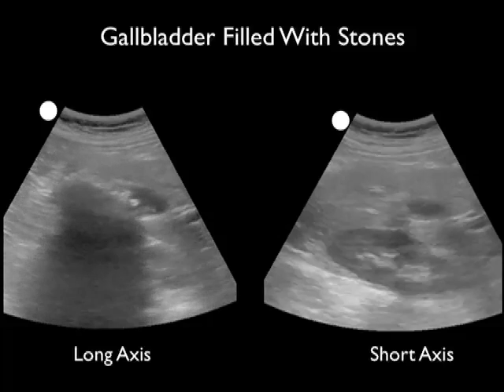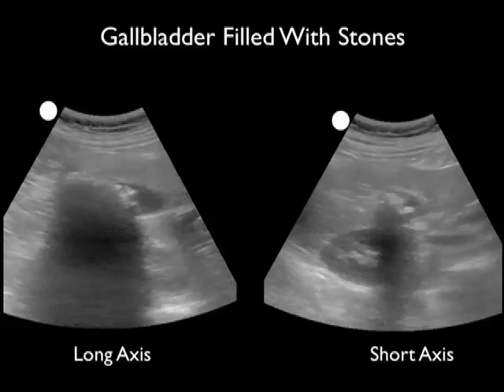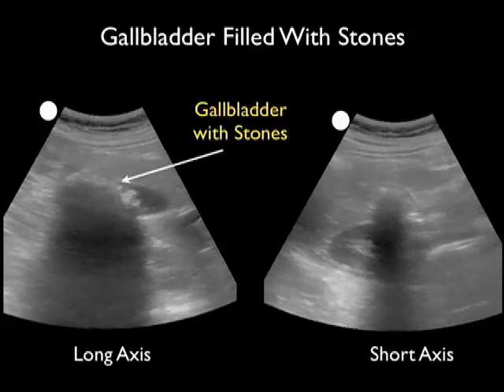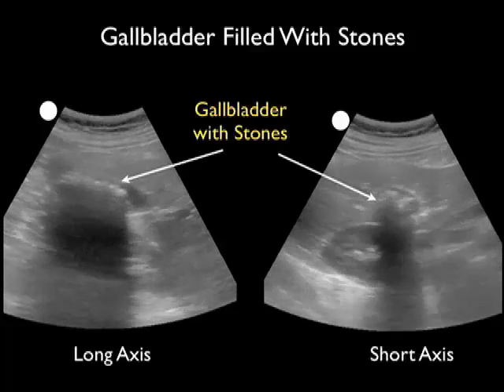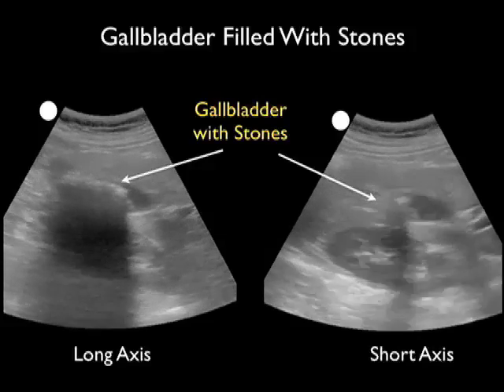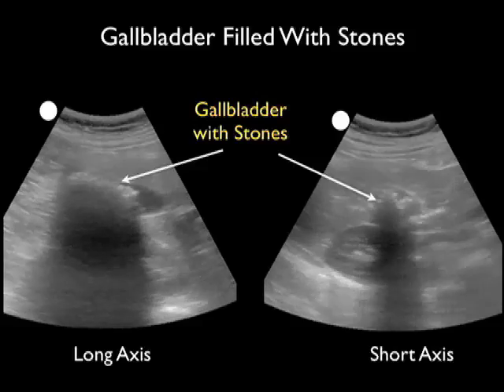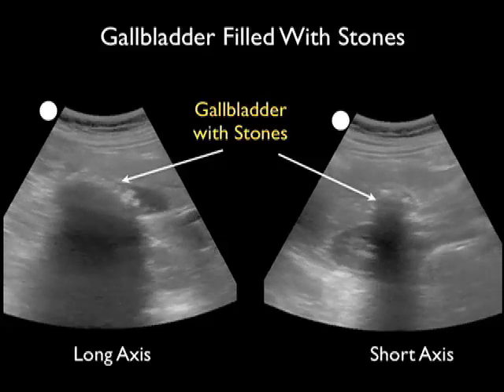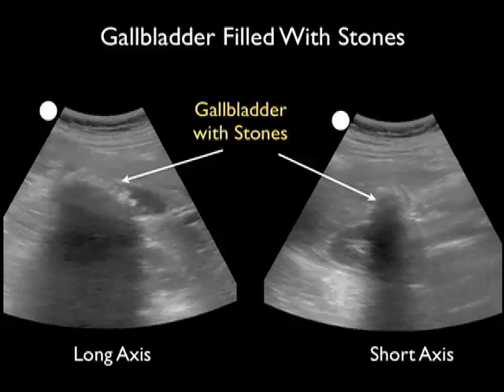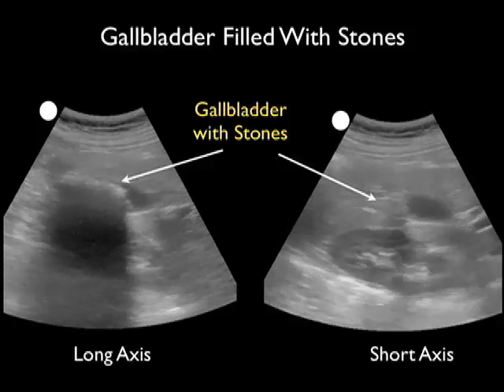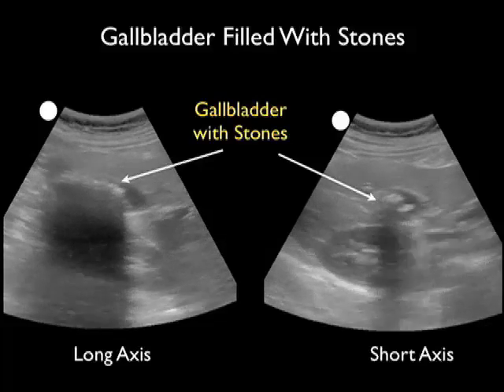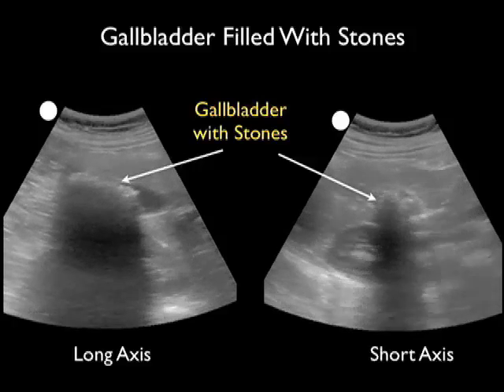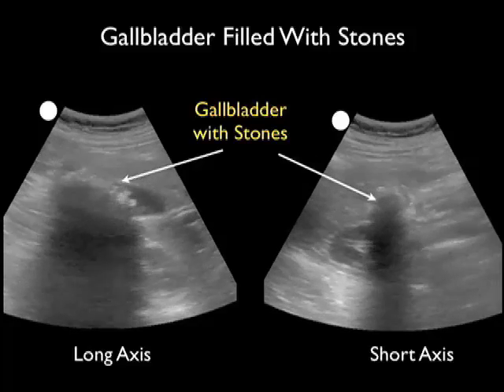A sonographic finding seen with a gallbladder completely filled with stones in a contracted state is the wall echo sign. Here we see an example of the wall echo sign in long axis on the left and short axis view on the right. What we see is the gallbladder filled with stones — all we see is the anterior wall of the gallbladder, the echo from the concretion of stones, and the shadow off the back of the stones making the sign. The wall echo sign is pathognomonic for a gallbladder completely packed with stones in a contracted state, and it can occasionally be difficult to find the gallbladder when all you see is this sign.